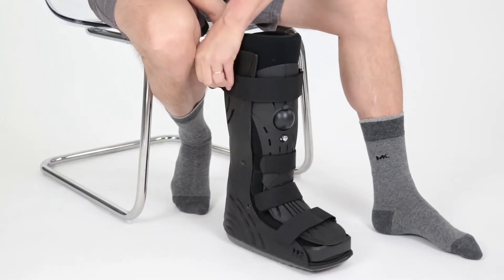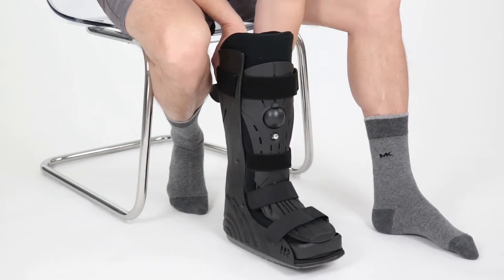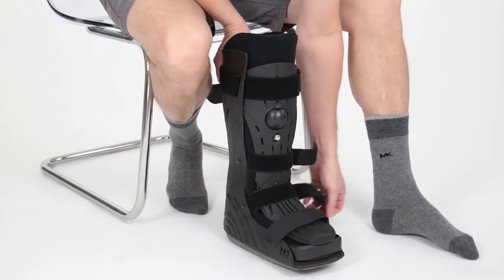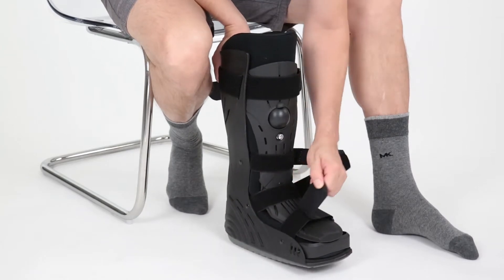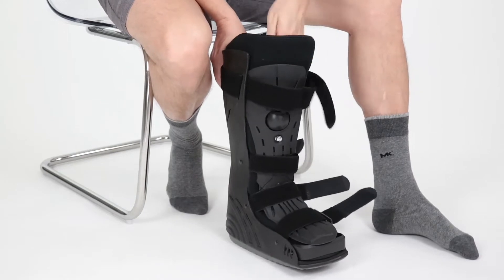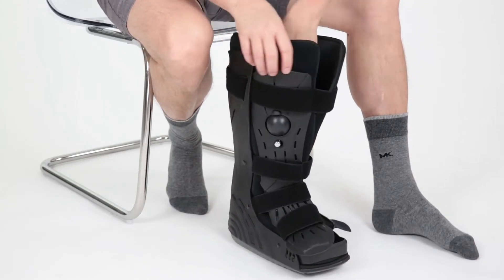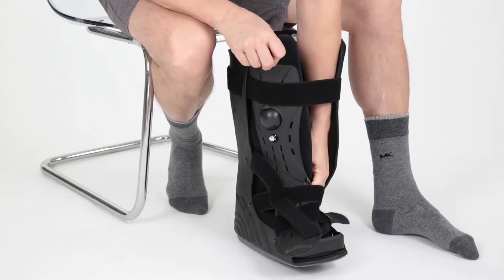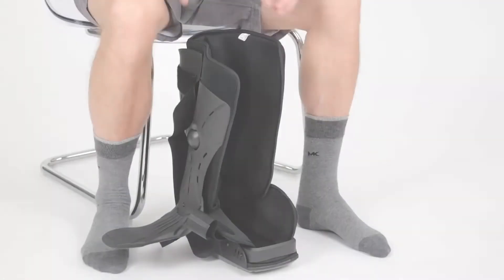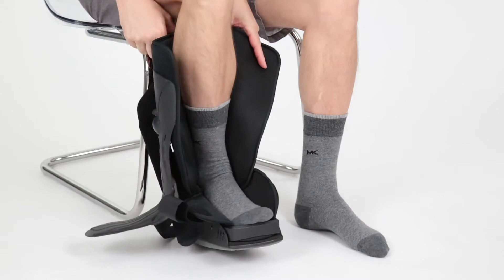Start by unfastening all straps, then open the liner. Place your foot inside, making sure the heel reaches the back of the brace.